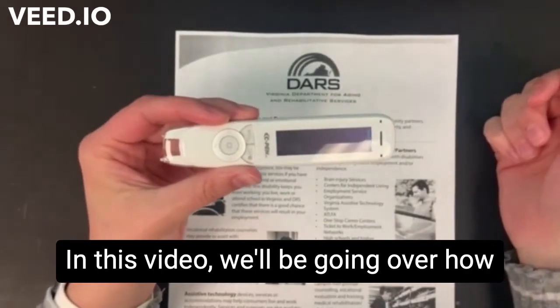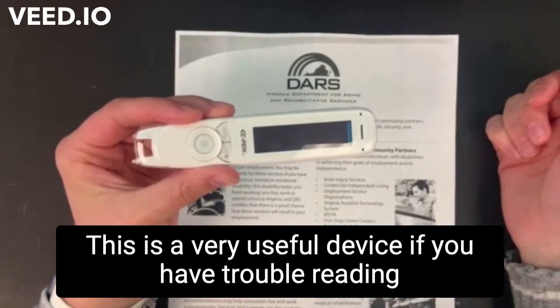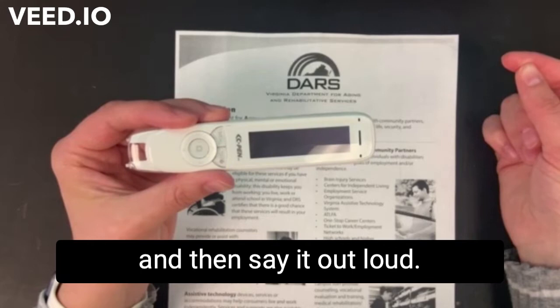Hi everyone, Josephine with Starz here. In this video we'll be going over how to use the C-Pen Reader. This is a very useful device if you have trouble reading from hard copies because it will read the hard copy for you and then say it out loud.